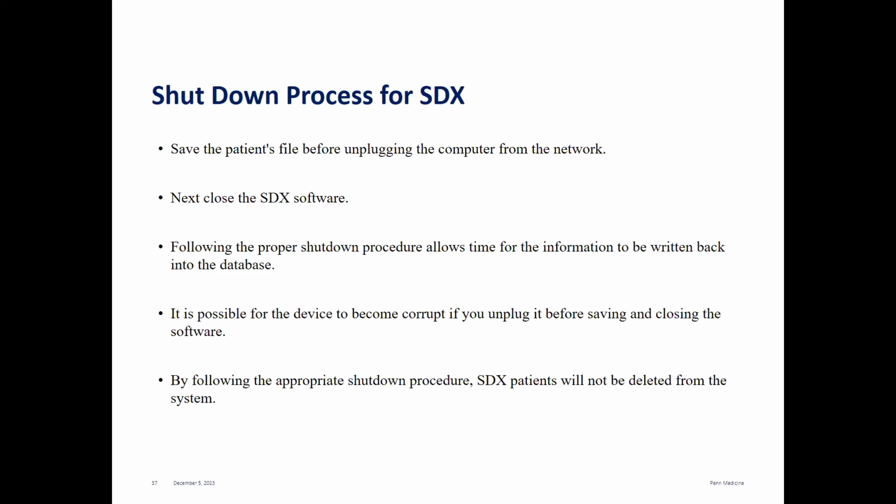Okay, so this shutdown process of the SDX is very important. You have to save the patient's file, of course, before unplugging the computer from the network. You would then close out the SDX software with the home button. It'll ask you to save. Following the proper shutdown procedure allows time for the information to be written back into the database. It is possible for the device to become corrupt if you unplug it before saving and closing the software.